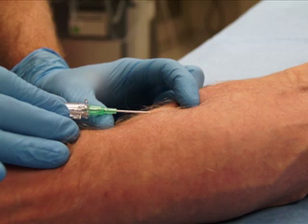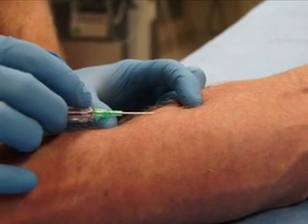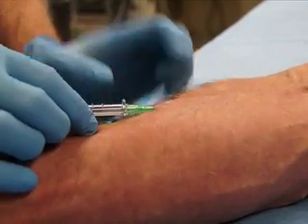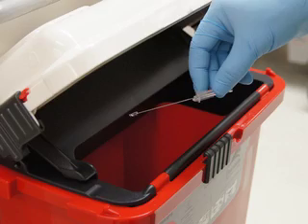When the needle tip enters the vein, there will be a flash of blood into the catheter. Decrease the angle of the needle and advance 1 to 2 millimeters further to ensure that the entire needle tip and the tip of the catheter are fully within the vessel. While holding the needle still, slide the catheter into the vein. Apply firm pressure to the vessel proximal to the tip of the catheter. Remove the needle and place it into a sharps container.